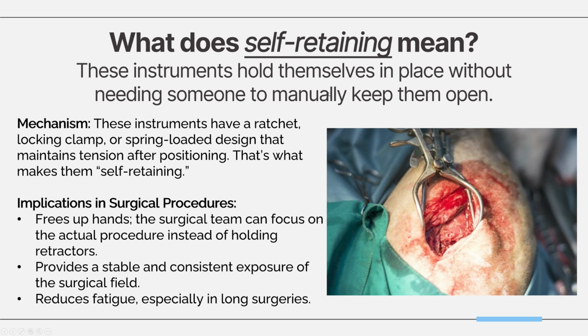All right, so now we're going to get into what self-retaining actually means. These instruments hold themselves in place without needing someone like the surgeon or a scrub nurse or any other OR personnel to manually keep them open.